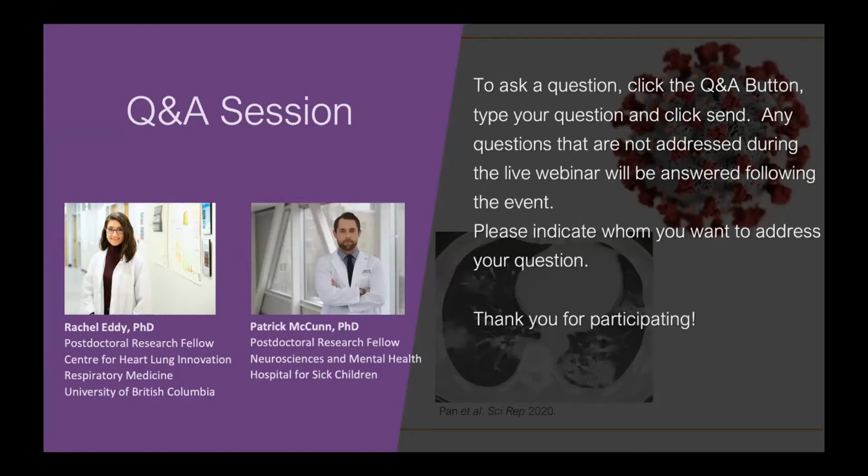Yeah, well, that is a whole other area, I guess. I'm more familiar with MR motion artifacts than if you're thinking of, say, lung imaging or something. There's various gating possibilities. A lot of motion artifacts in neuroimaging are commonly post-processed.